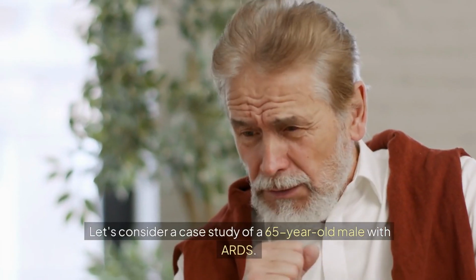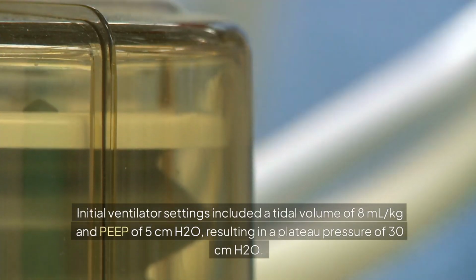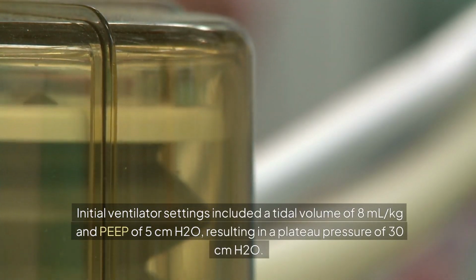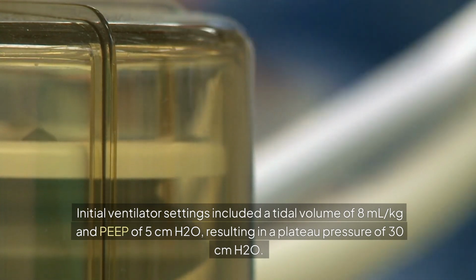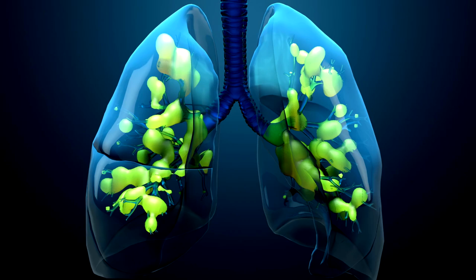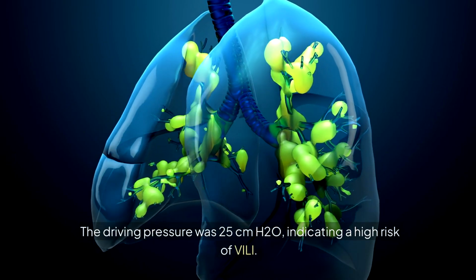Let's consider a case study of a 65-year-old male with ARDS. Initial ventilator settings included a tidal volume of 8 ml/kg and PEEP of 5 cm H2O, resulting in a plateau pressure of 30 cm H2O. The driving pressure was 25 cm H2O, indicating a high risk of VILI.